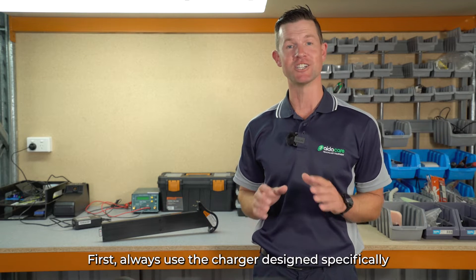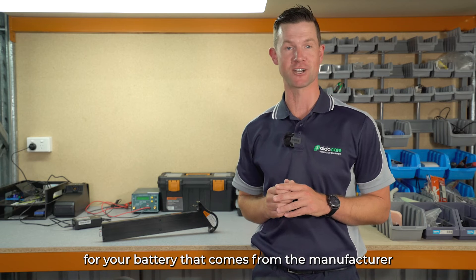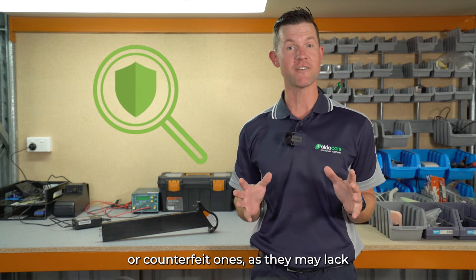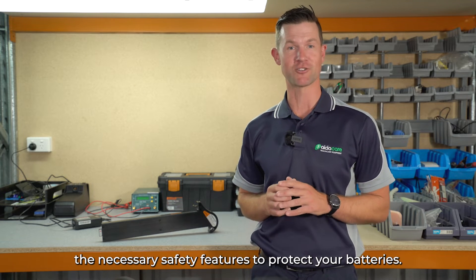First, always use the charger designed specifically for your battery that comes from the manufacturer. Avoid using cheap, off-brand chargers or counterfeit ones, as they may lack the necessary safety features to protect your battery.